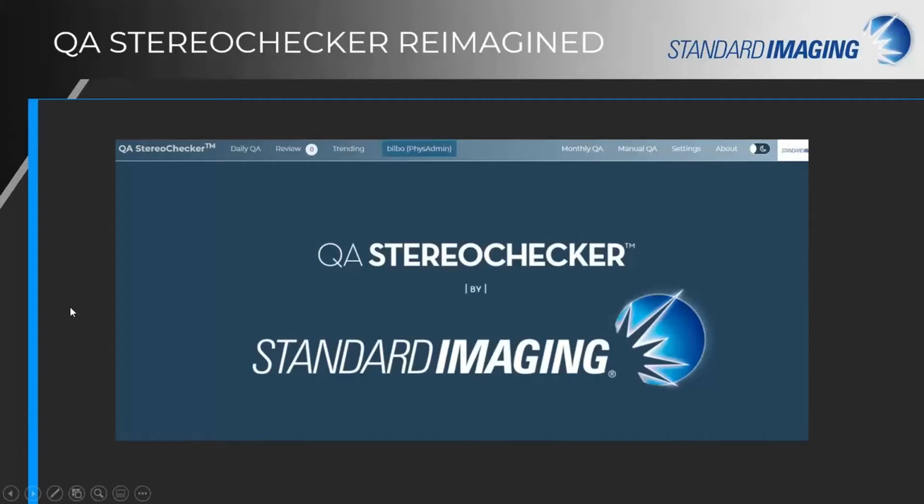The upcoming QA StereoChecker release offers a reimagined, locally hosted web application, making navigation throughout the software easier and faster. While a user acquiring data will lock out other users from performing QA, additional users may access the software at the same time to review QA or examine QA trending data. Images are acquired with a single click, and within mere seconds, the full image analysis is done with the results displayed, saved, and trended automatically.